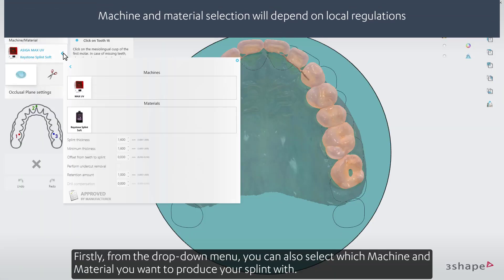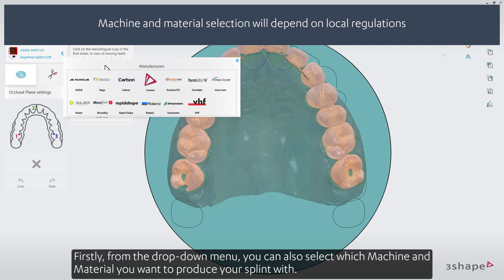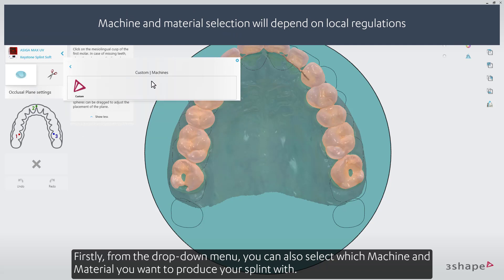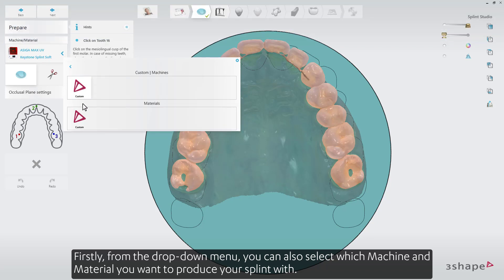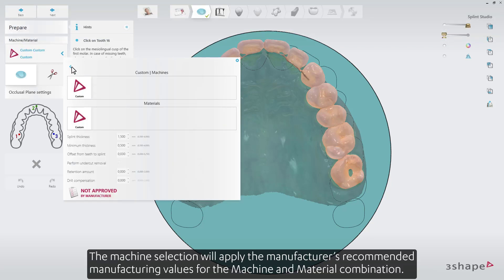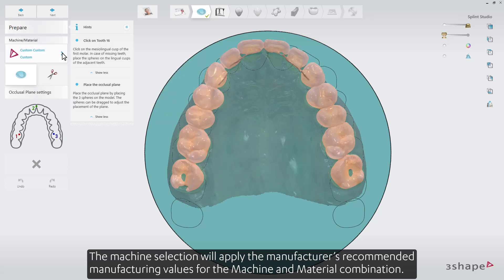From the drop-down menu, you can also select which machine and material you want to produce your splint with. The machine selection will apply the manufacturer's recommended manufacturing values for the machine and material combination.